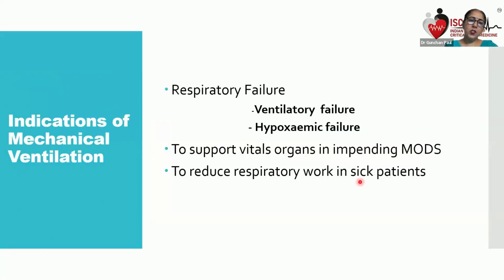So what are the indications? Why do we need to put the patient on mechanical ventilation? The first and the foremost indication is respiratory failure. So respiratory failure is of two types. It is ventilatory failure or hypoxemic failure.